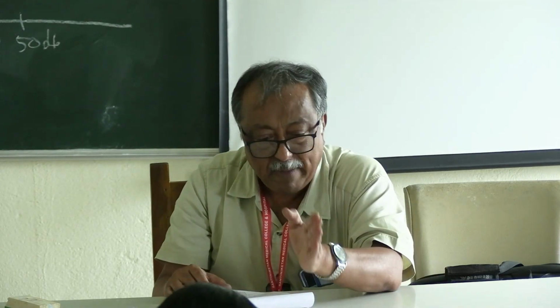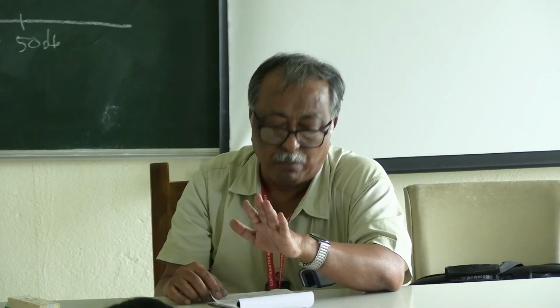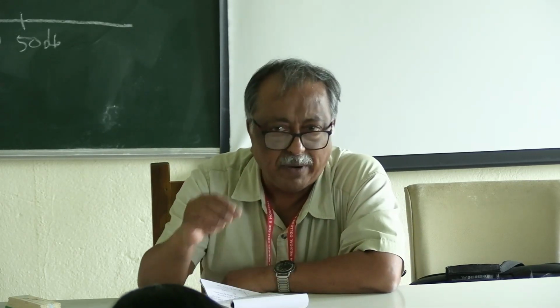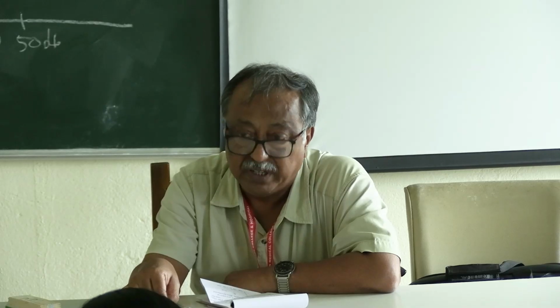That means recruitment is more in cochlear pathology. Fowler's test, recruitment test, and SISI, the percentage is more than 70% for cochlear pathology, but in tone decay, the neural pathology, the decay is more. These are all subjective tests. If the patient or the client is not cooperative, the baby is not cooperative, then we cannot do it.